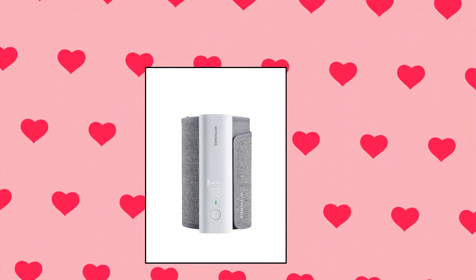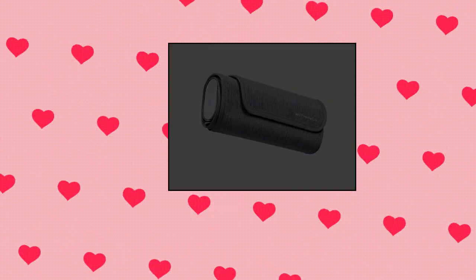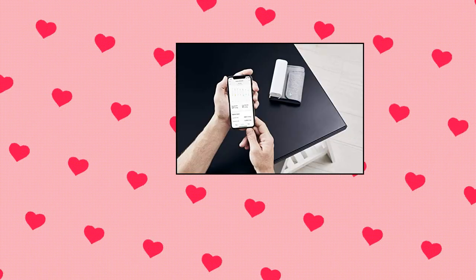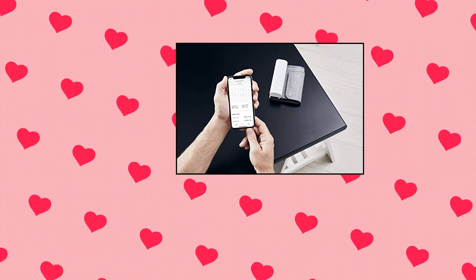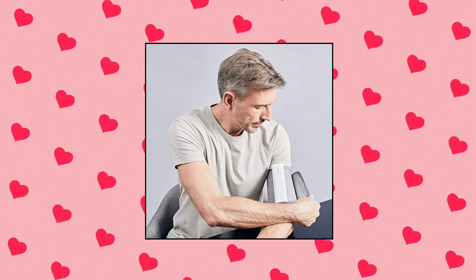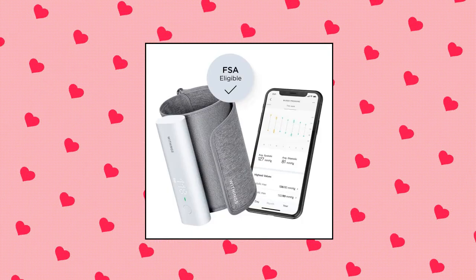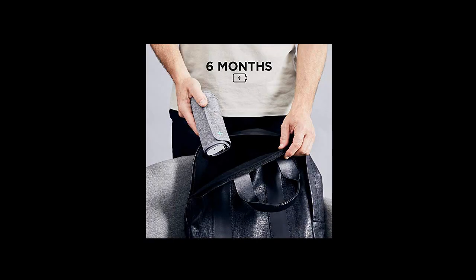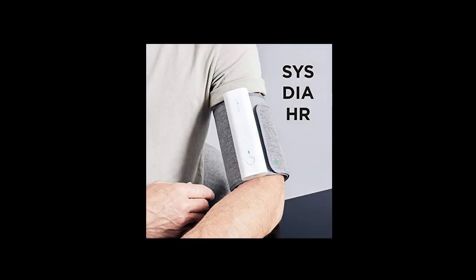Withings BPM Connect — digital blood pressure cuff and heart rate monitor. Quick and easy to read results with color-coded feedback on the display. This blood pressure cuff measures systolic and diastolic. Ideal for individuals with high blood pressure and one of the most accurate blood pressure monitors. FDA cleared portable automatic blood pressure monitor for easy at-home arterial activity monitoring. FSA approved.